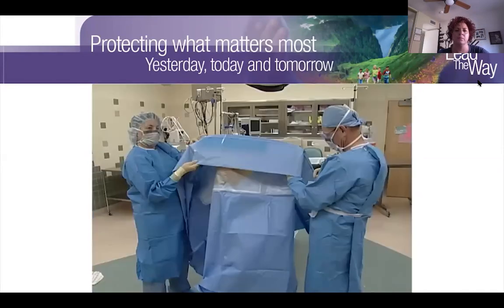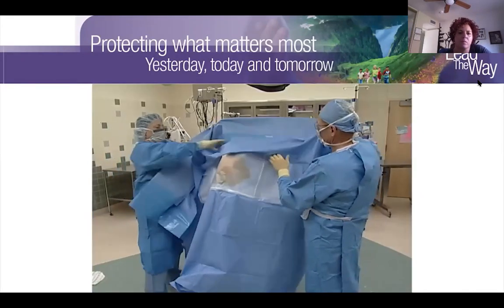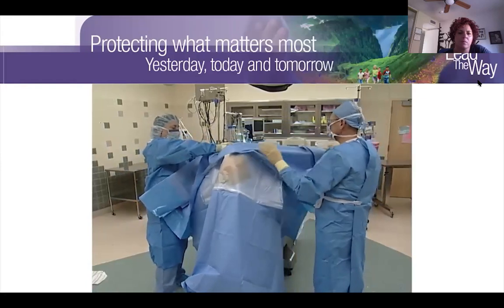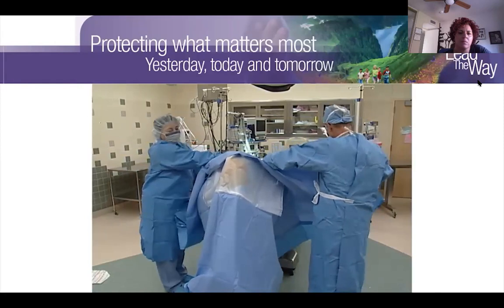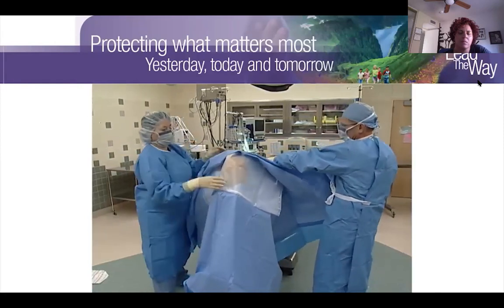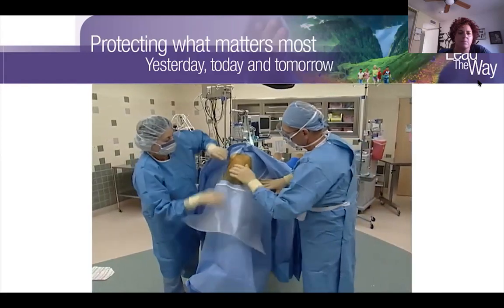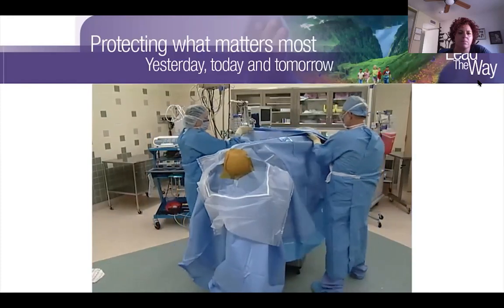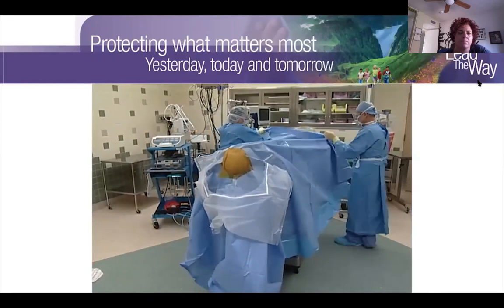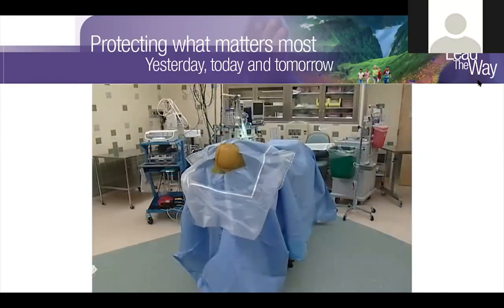Place the adhesive strip on the patient's chest and gently apply pressure. The 3M adhesive used on this drape is pressure sensitive. You will have better adhesion if a small amount of pressure is applied before continuing with the unfolding. Once the adhesive is in place, bring the pouch down. Continue unfolding the drape toward the feet of the patient. The patient is now ready for the procedure.